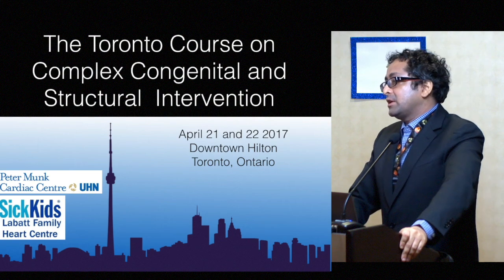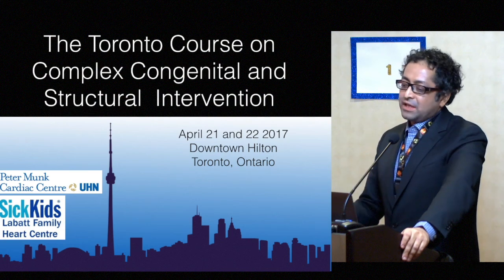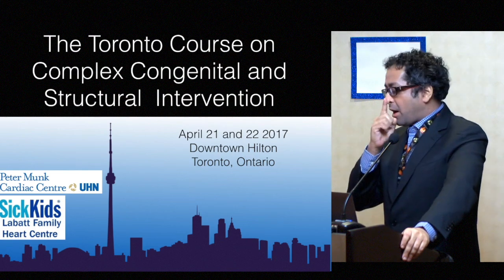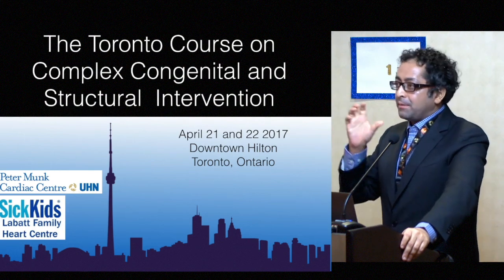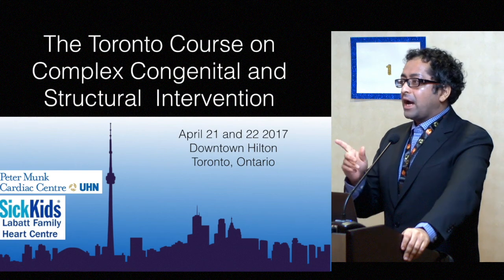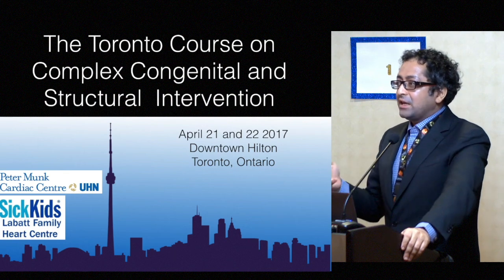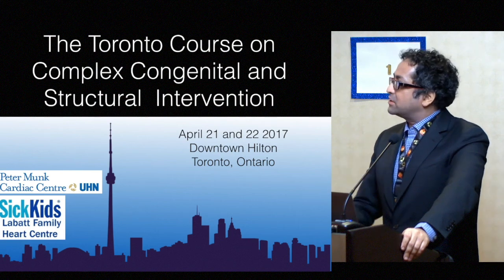It's an interesting thought, because in the TAVI world, when we do these valves where we think the leaflets or overhang are borderline or the coronaries are borderline low, we'll often, and I was thinking about that complication case presented, wire a priori and have a stent in place, even pull the guides up, deploy the valve, and if you don't need the stent, take it out, or deploy the stent if you need to. A couple times in the left main it saved us, and a couple times in the right. But I'm not sure, this would be a different issue, because this would be going down to the mid-circumflex with the compression. I guess the same principle could apply, but I have not seen that done yet, protecting the circumflex while doing it. It would be easier, certainly, because your aorta's free to go.